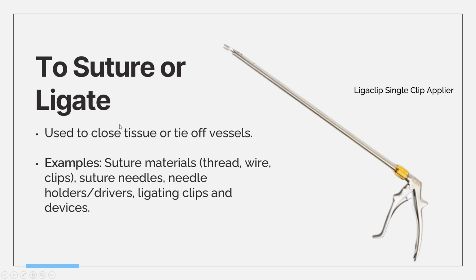Clue in the name. And sutures, of course, must be used. These are threads used to close wounds, available in absorbable or non-absorbable types based on surgical requirements. And we don't actually sterilize suture materials. They are obviously going to become a part of the patient.